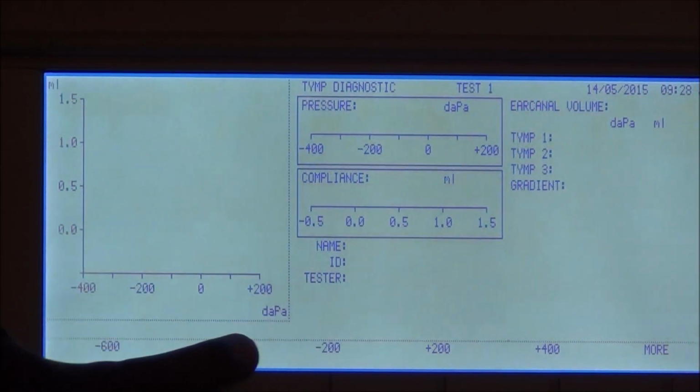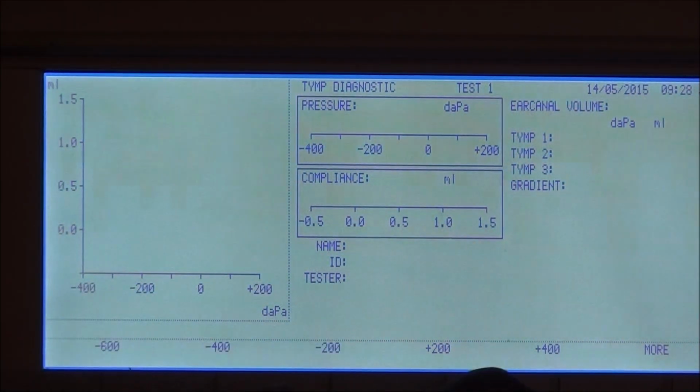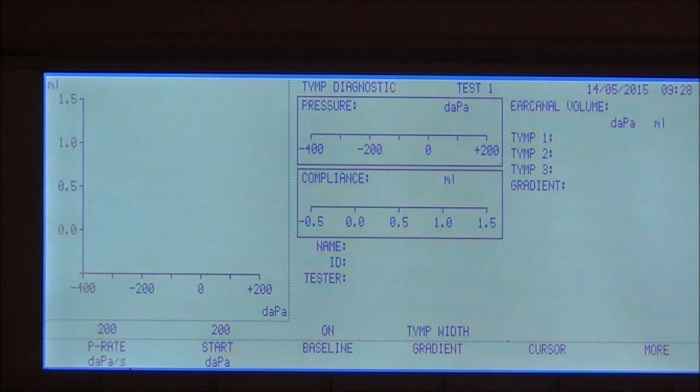In this case, as of now, we will not be changing it unless a need occurs. We can start from positive pressure to avoid clinical discomfort for the patient. Building a negative pressure all of a sudden will cause a lot of discomfort for the patient, especially for those people who have vestibular disorders. And it will be uncomfortable for anybody. So generally we prefer starting at positive, but when a need occurs, we need to cross-check.